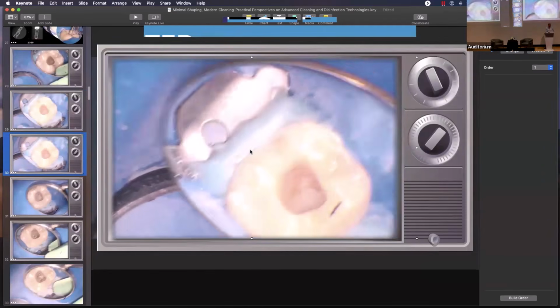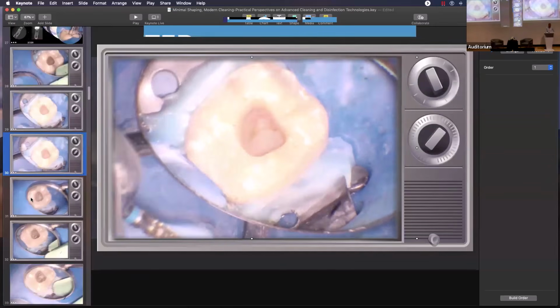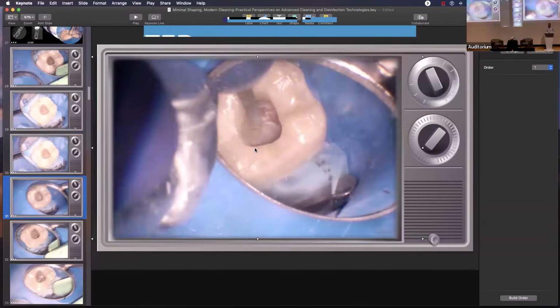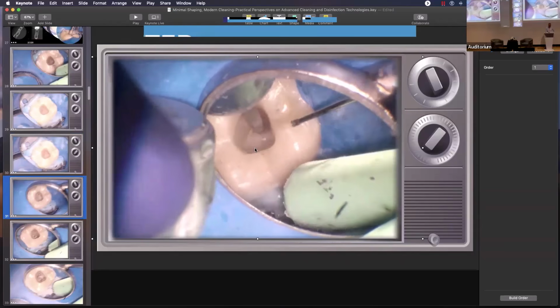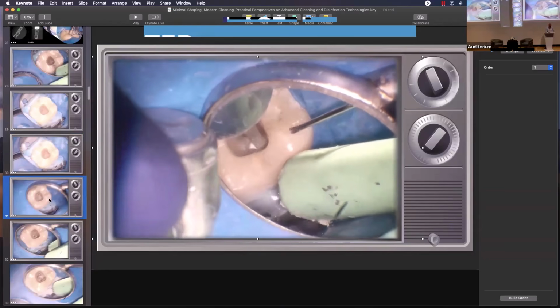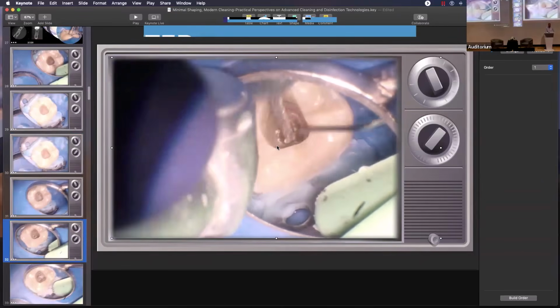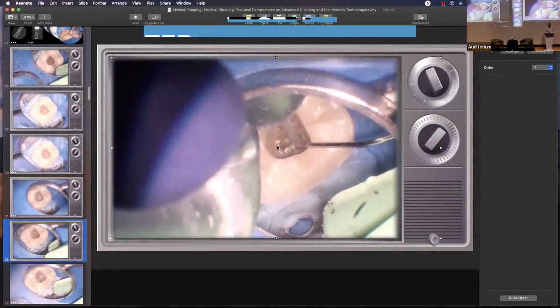So now we're basically down to restorative. We're through the crown. Here we go. We'll switch to a round-ended taper diamond, wet. Here comes the chair side with water. This is going to get us a good chunk of the rest of the way down, and then we're going to go dry. For the final bit of access, we're going to switch to an LA access, so that last little precise bit.